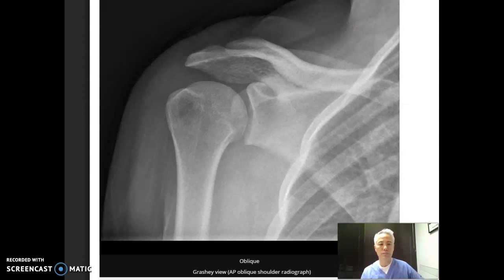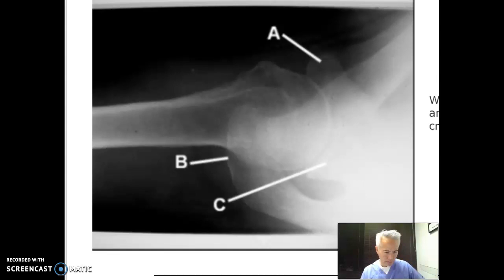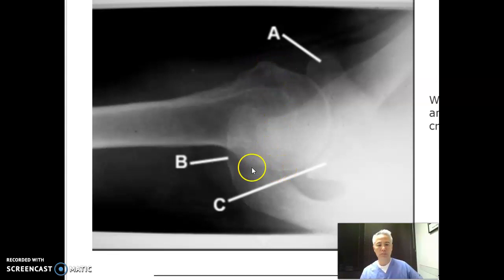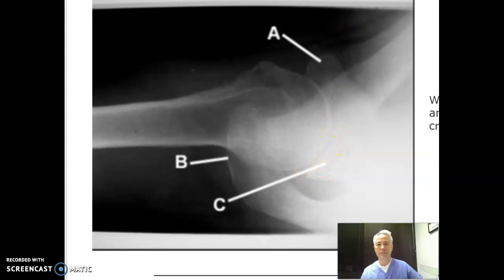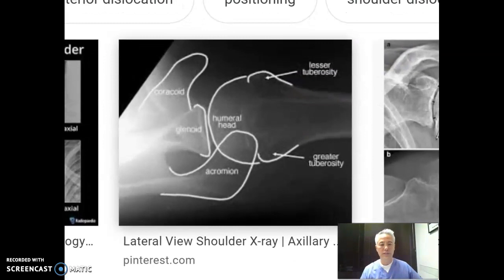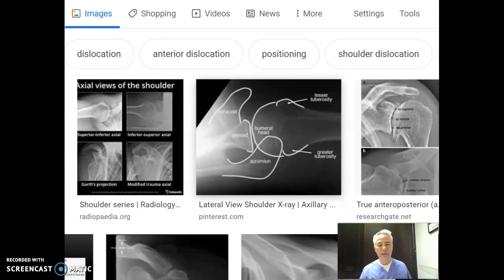The axillary view is basically a view to tell us if there's any kind of dislocation. You can see dislocations on other views as well, but this one specifically is for dislocations. You can see the lesser tubercle up here, the greater tubercle towards the bottom, the acromion coming across and going right over the neck and part of the head of the humerus, and then the glenoid cavity right towards the bottom. This is typically a tabletop view done on a 10 by 12 with the patient leaning over, and we'll show you those positions in just a minute.